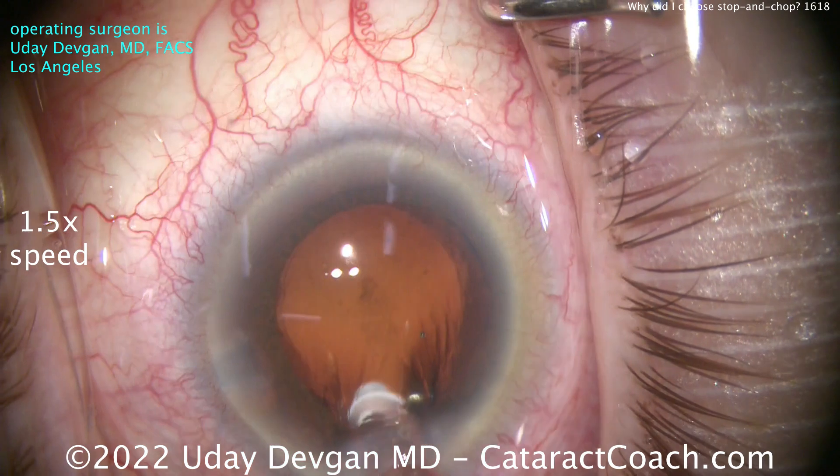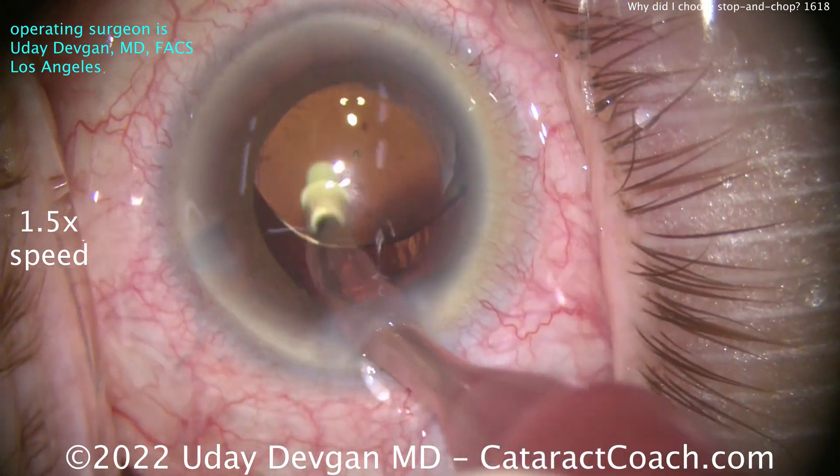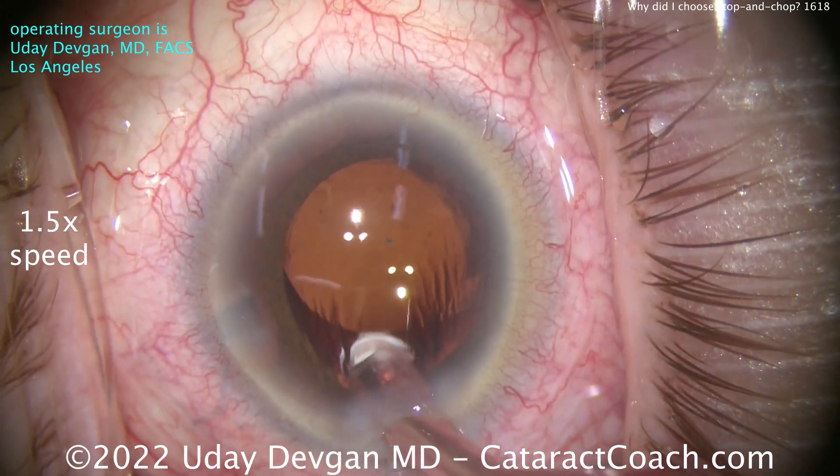Now going back in, getting that sub-incisional cortex — that little bit can be removed. Let's go behind the IOL. The rest of the case is going to be pretty easy.